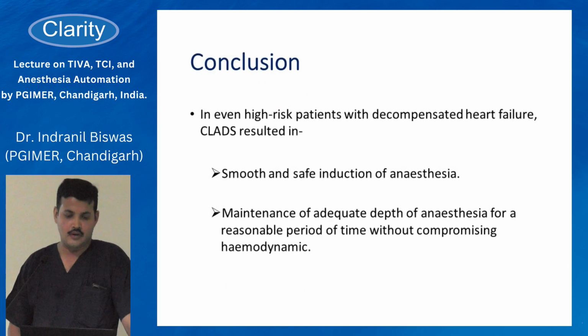So in conclusion, even in high risk patients with decompensated heart failure, CLADs resulted in smooth and safe induction of anesthesia and maintenance of adequate depth of anesthesia for a reasonable period of time without compromising hemodynamics too much.